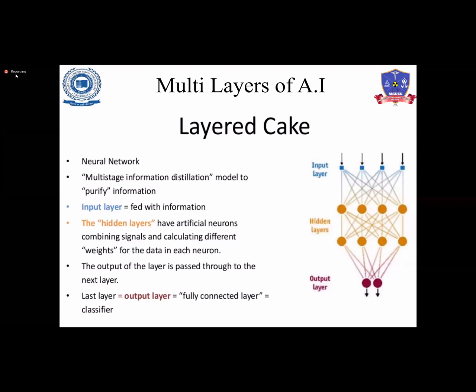To know in detail about these neural networks, how the systems technically work and what kind of algorithms we use, this is a part of engineering technologies. That is on their part, but definitely in future we people will have to use these kinds of equipment. Then definitely we must be aware of how the system works.